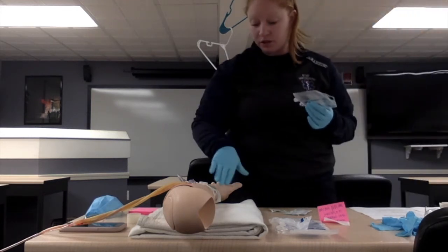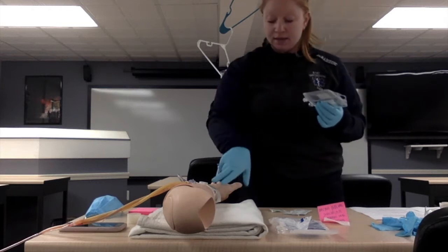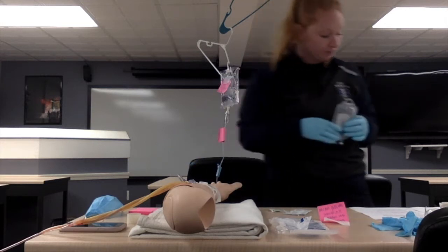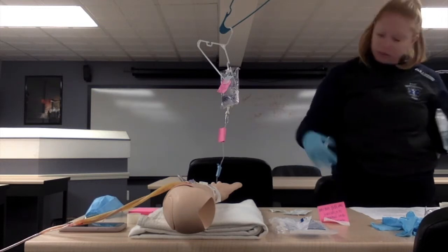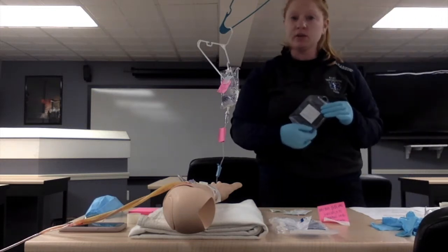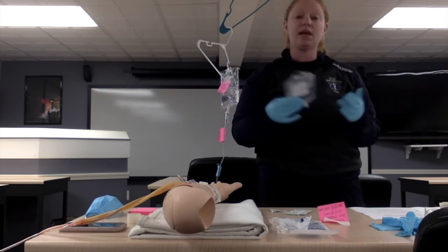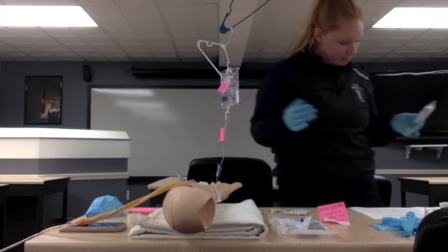Before we do anything, we're going to make sure that the IV from the infusion that was started still has no infiltration, that there's no issues with it, no redness, swelling, tenderness, no complications so far. So once we know that there's no issues with that, we're going to explain to the patient this is an antibiotic that you're receiving from the doctor, ask if there's any questions, educate her on some of the side effects, why she's receiving it, how long it'll take, how often she's going to get it, and so forth.